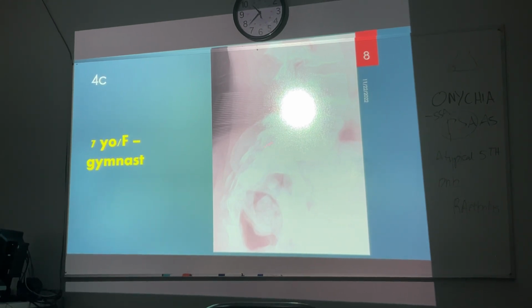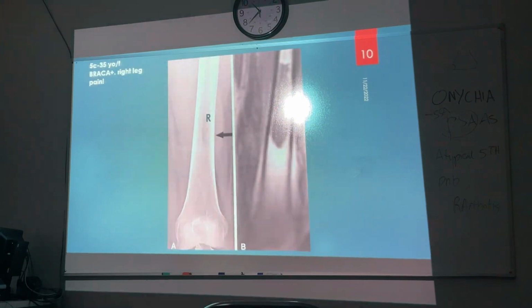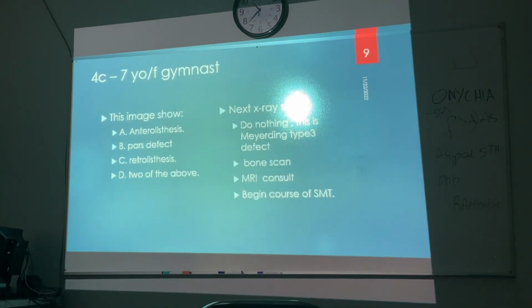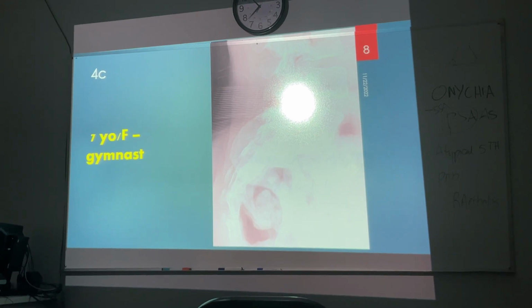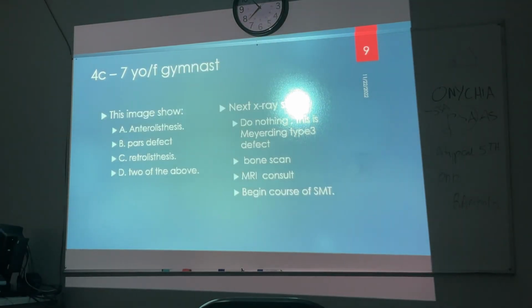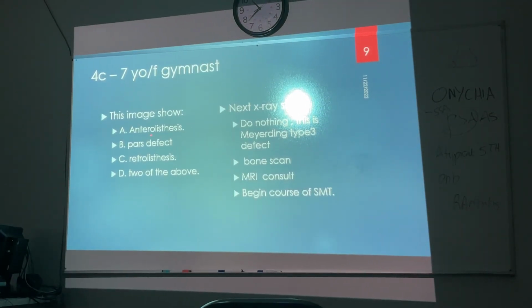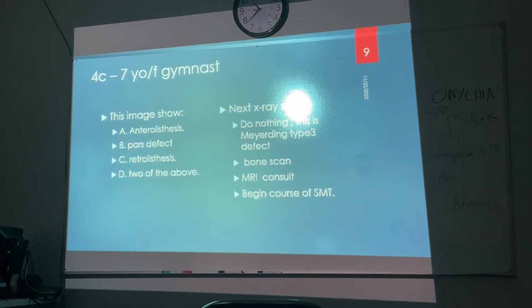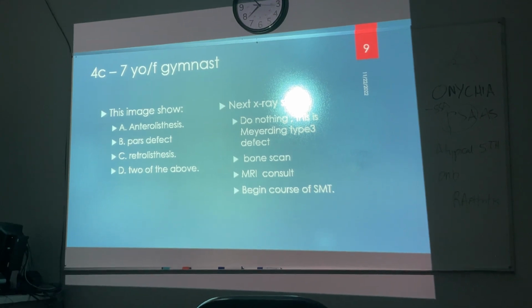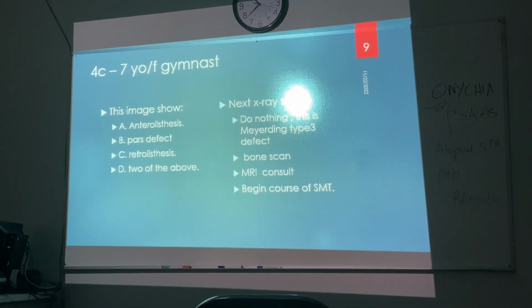Doesn't show well, but there's an offset. Okay, there's a big offset, L5S1, doesn't matter. What would you do? You need to make sure if you have an anterolisthesis you rule out this. How do you rule out this? AP lumbosacral spot view, okay? That is your first choice, or obliques.